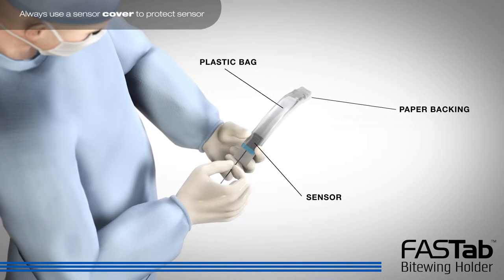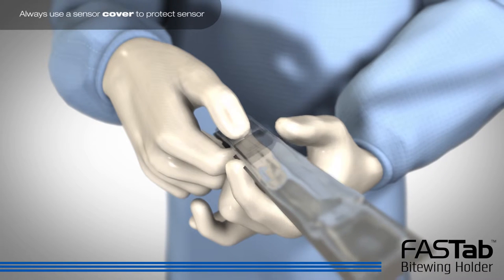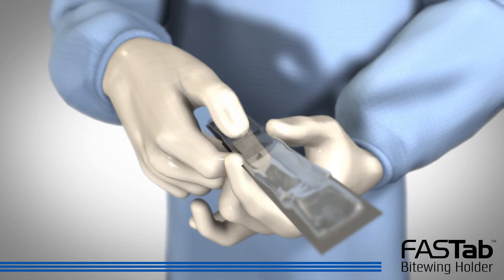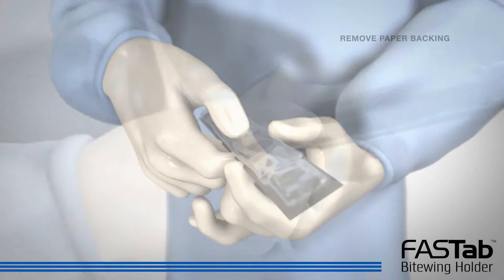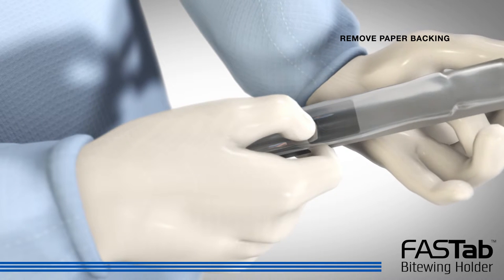Insert the sensor flat side down facing the white tab. Important note: the front of the RIN sensor cover is designed for permanent adhesion. Adhesive holders will not bond to the back side of the sensor cover. Once the sensor is about halfway into the sensor cover, remove the paper backing from the sensor cover.